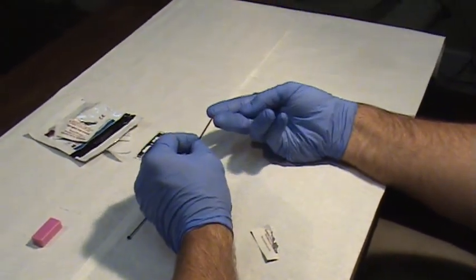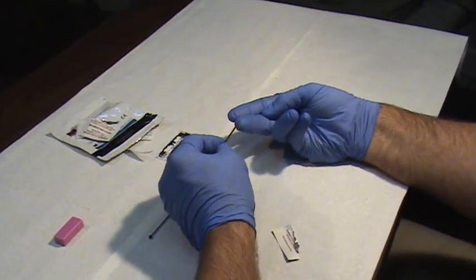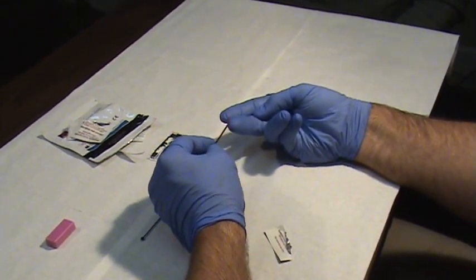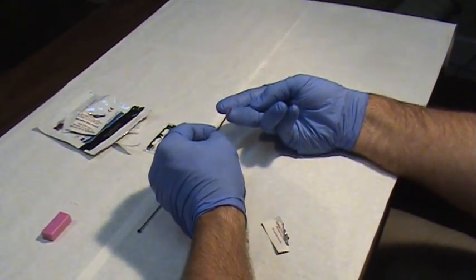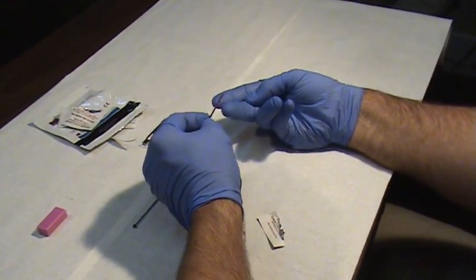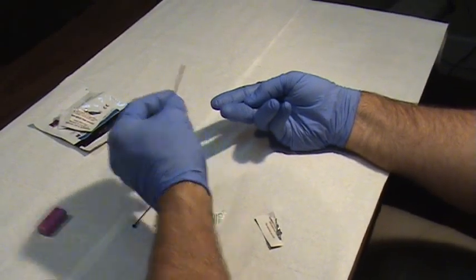You want to be careful when you're taking a blood sample not to scrape the skin cells. If you need to lift it up and place it back down, lift it directly off the skin, place it back down to the blood source, not against skin cells because you'll get a false reading.